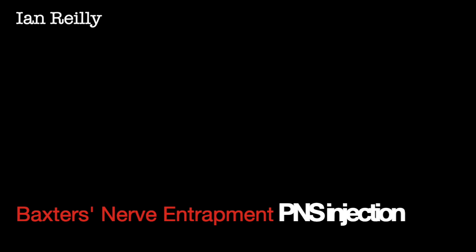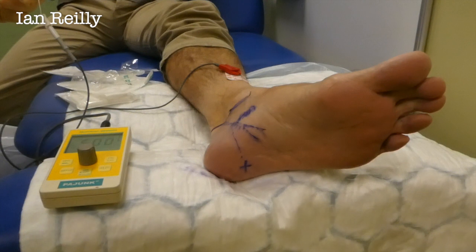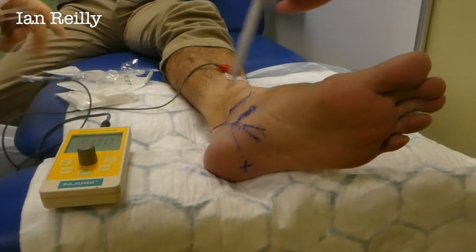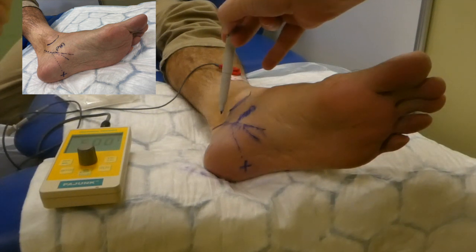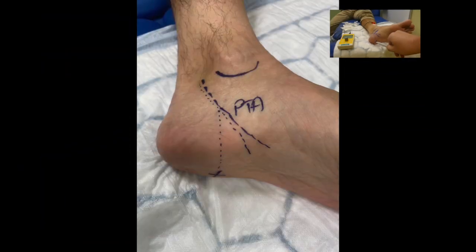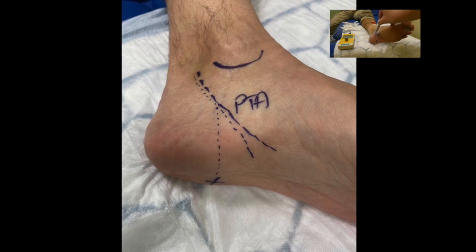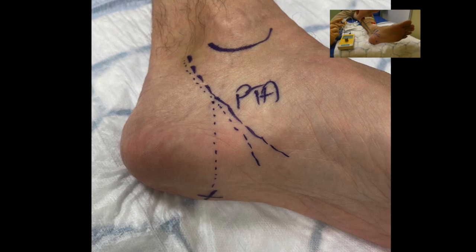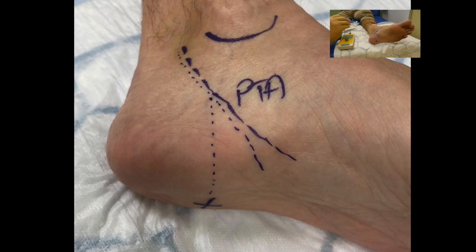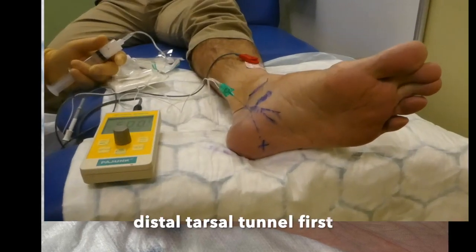We've marked Peter up and put a little bit of skin prep on. We've got the edge of the medial malleolus here, followed down the artery and nerve. Peter's main problem is really Baxter's nerve — plantar lateral pain — so this is the course of the first branch of the lateral plantar nerve, with a little bit of soreness in the distal tarsal tunnel as well. High volume guided injection — three, two, one, scratch — well done sir.